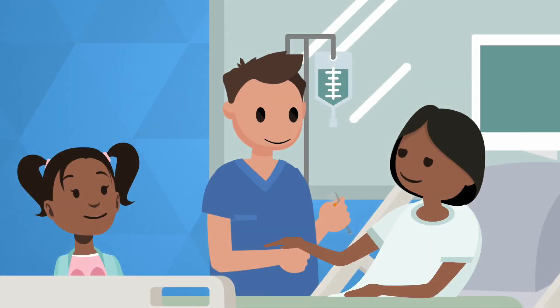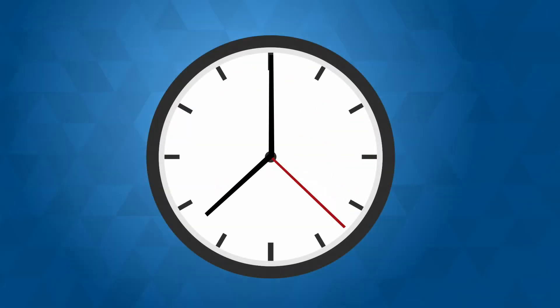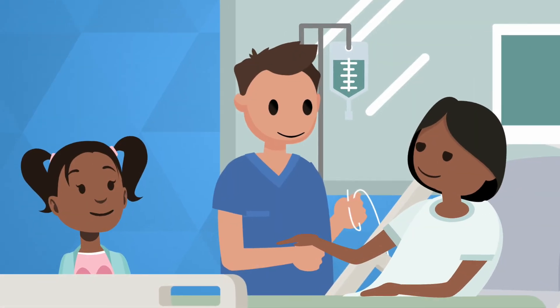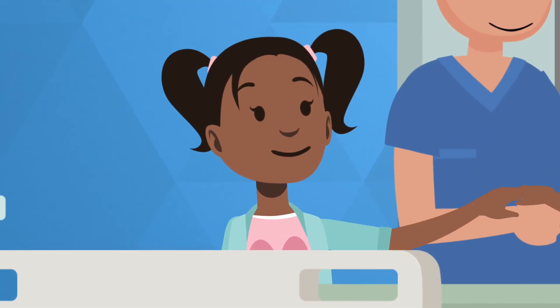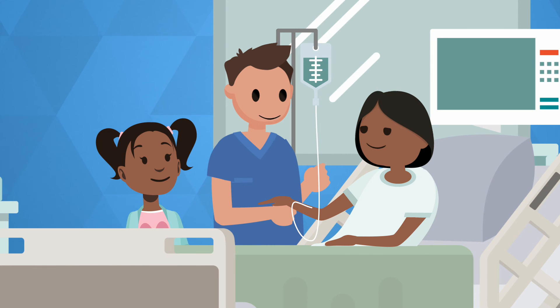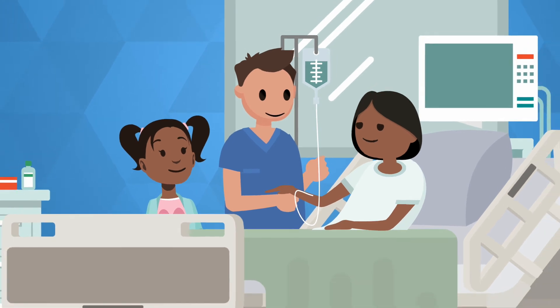Is that it? Yes. For the J-tip, that's it. Now we're going to wait two minutes and then I will start your IV. Are you ready? Yes, I'm ready. Don't worry, Mommy. I'll hold your hand. He's done. You can look now. Are you sure? Did he put the needle in already? It's already done. You did great. Thank you, Nurse Nate.